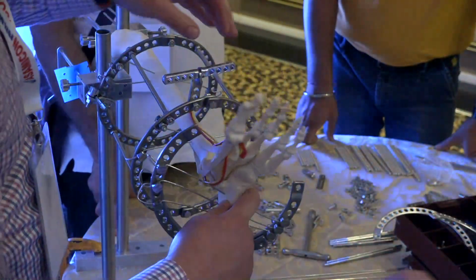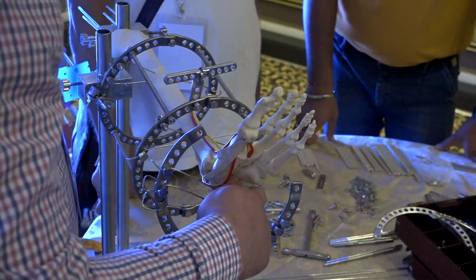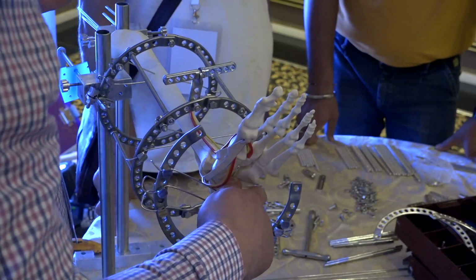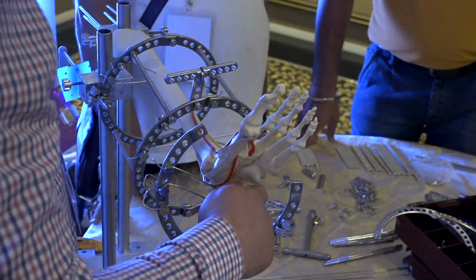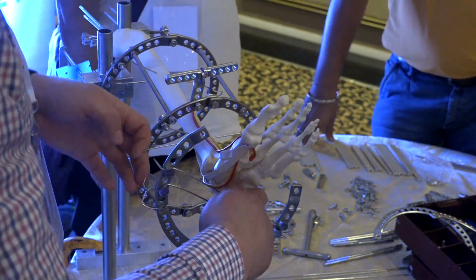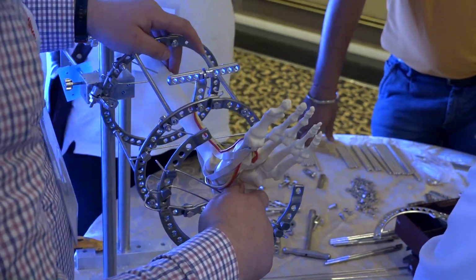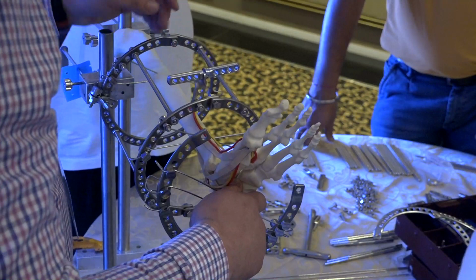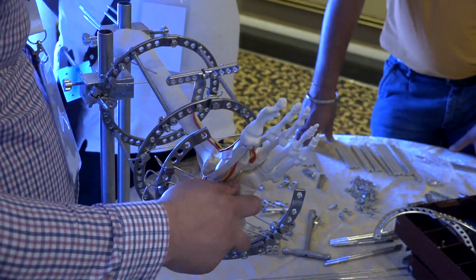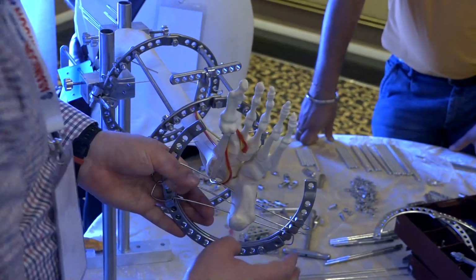Because, as you know, the foot is an anatomical region where we don't have enough soft tissues, like in the femur, for example. Olive wires on the calcaneum, for example, sometimes can give us complications, like inflammation of the skin around the wire. Now we will fix the forefoot.